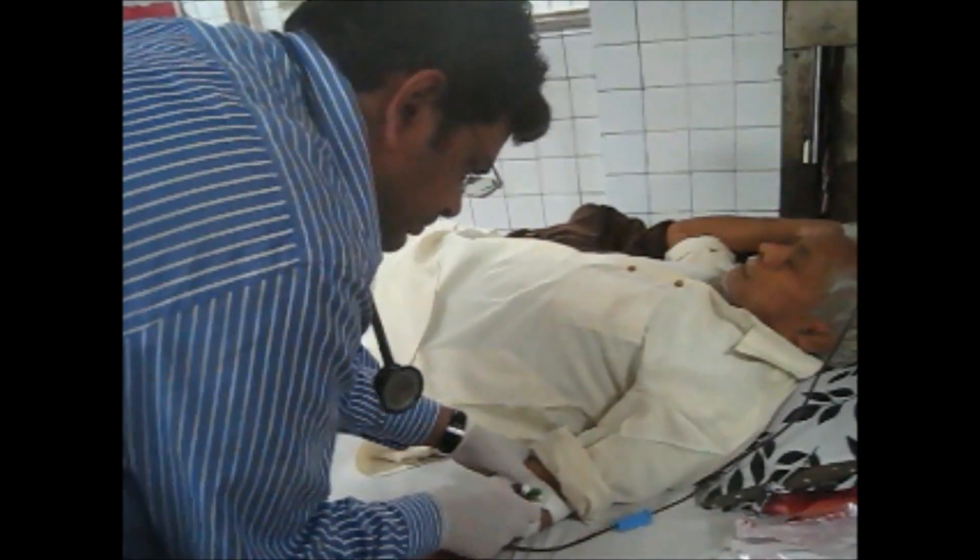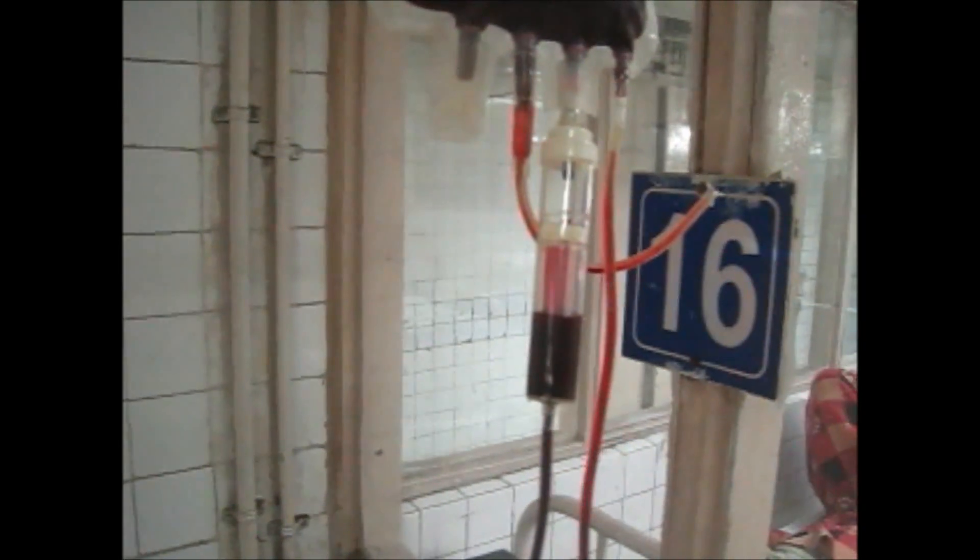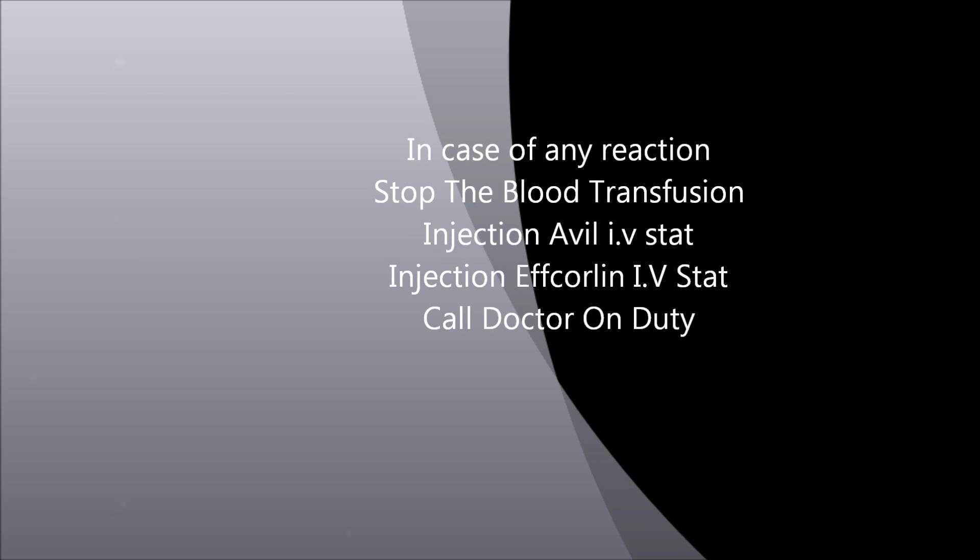Now you are attaching it to the cannula of the patient. You can see the blood coming out drop by drop. In case of any blood transfusion reaction, stop the blood transfusion and give the appropriate injection.